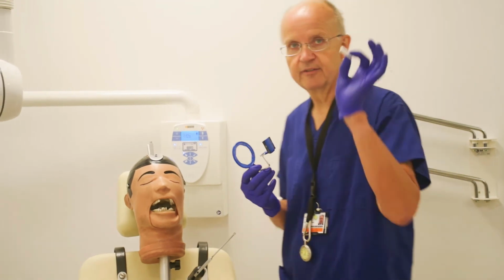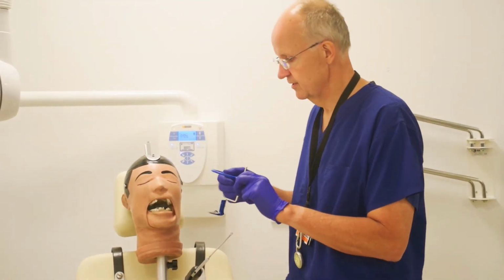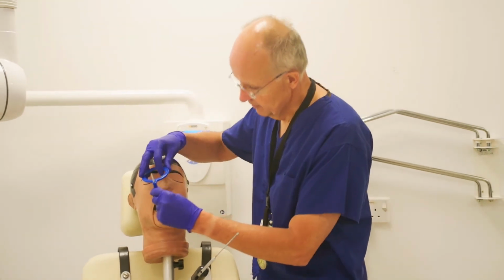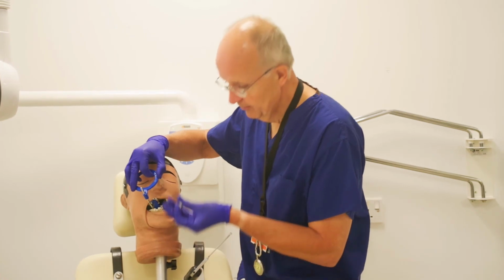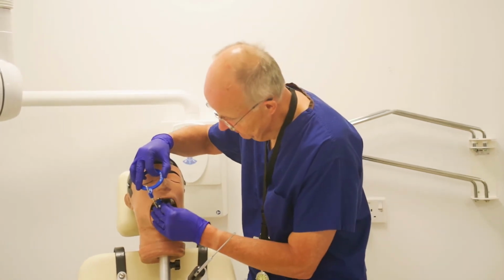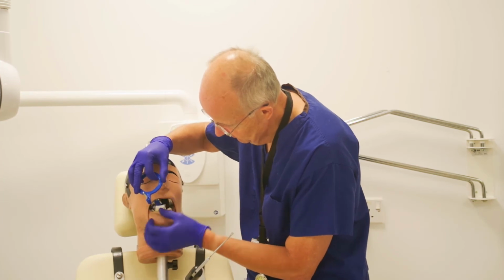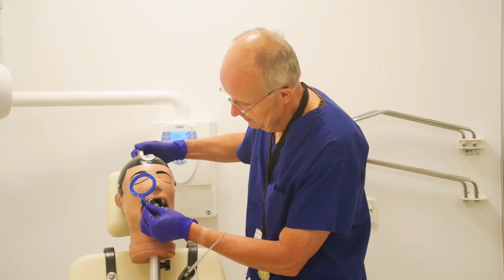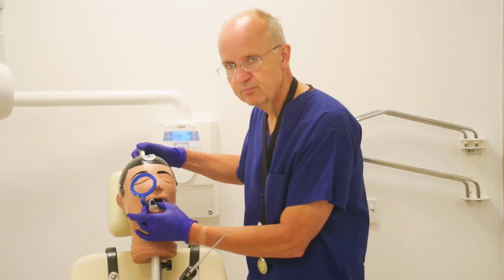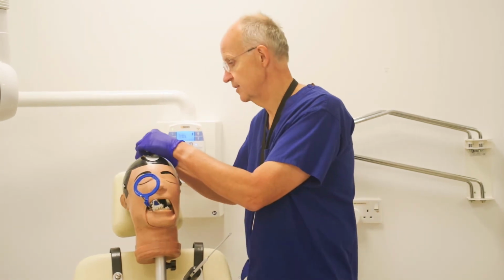Okay, thank you, Carlin, for that cotton wool roll. So we're going to have another go at positioning this in the mouth. Again, we'll ask Dexter to open wide, and place the holder up against the crown there. I'm going to place this cotton wool roll just underneath there, just across the arch of the lower jaw, and ask the patient to bite. Just compress that cotton wool roll, and you can see that's now holding it much straighter.